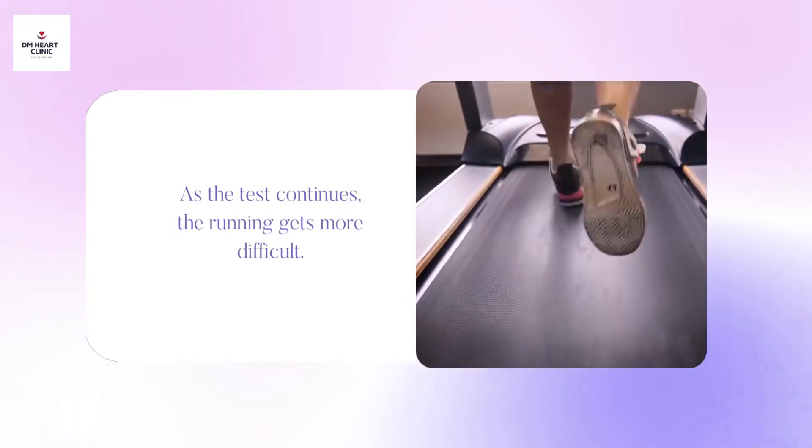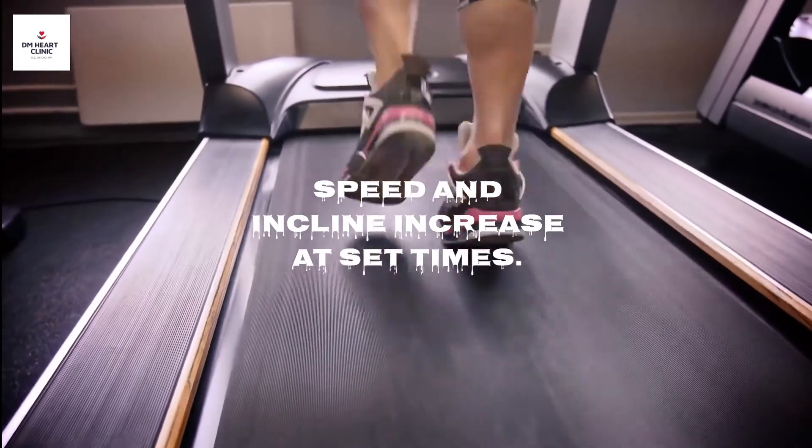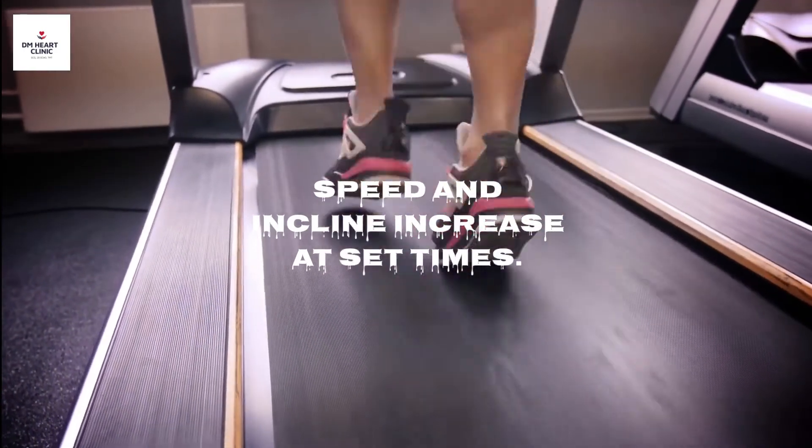As the test continues, the running gets more difficult. Speed and incline increase at set times — most commonly after every 3 minutes.